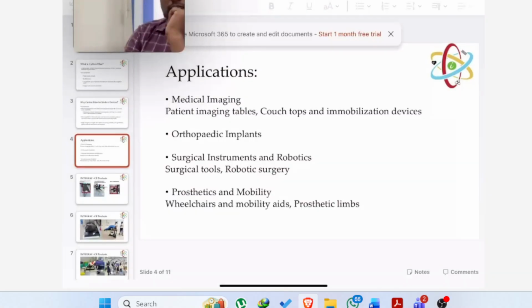The cobalt sources are different sources available for therapy for prostate, cervical and breast cancers, and there are many superficial cancers where they can do brachytherapy. For a deep-seated tumor, they use radiation beam delivery equipment that we call a cobalt machine or linear accelerator.